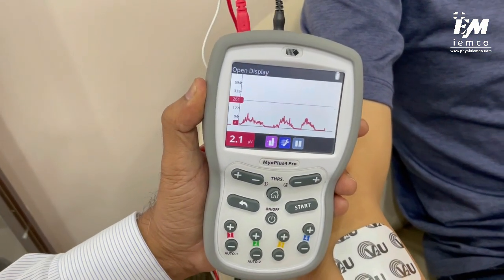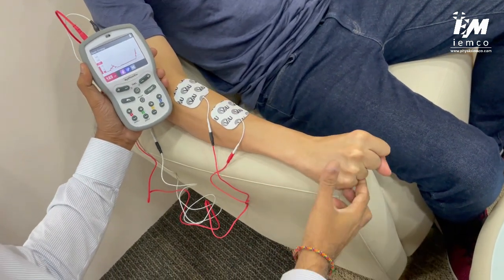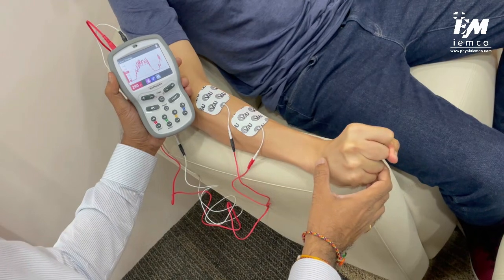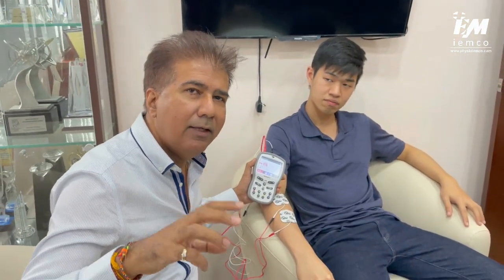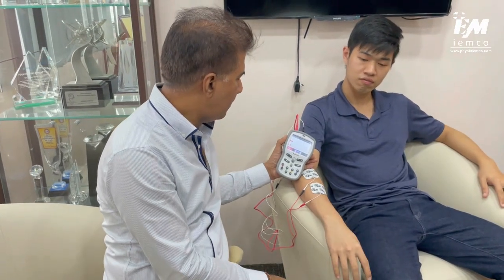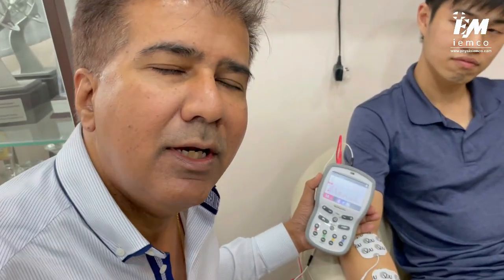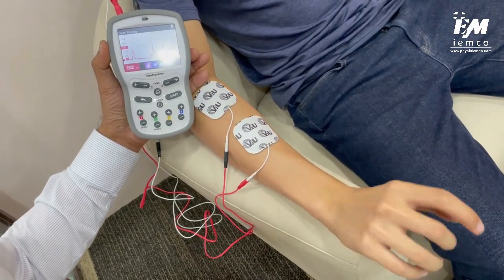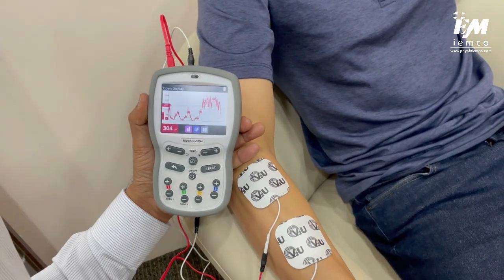Now I'll ask JJ to make a strong contraction. Contract strongly — up, up, up — good, and relax. When he was contracting very slowly with momentum-based movement, there was very little muscular activity, below 100 microvolts. But when he performs a strong contraction, he can reach a peak value up to 400 microvolts.